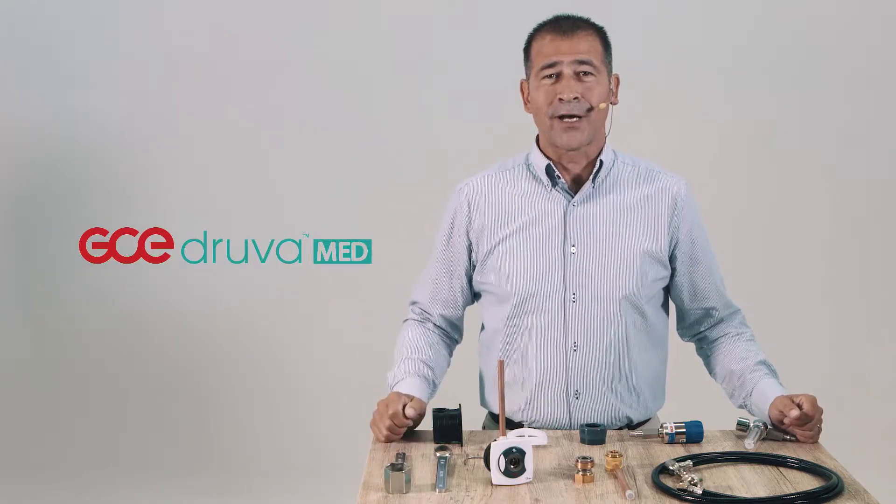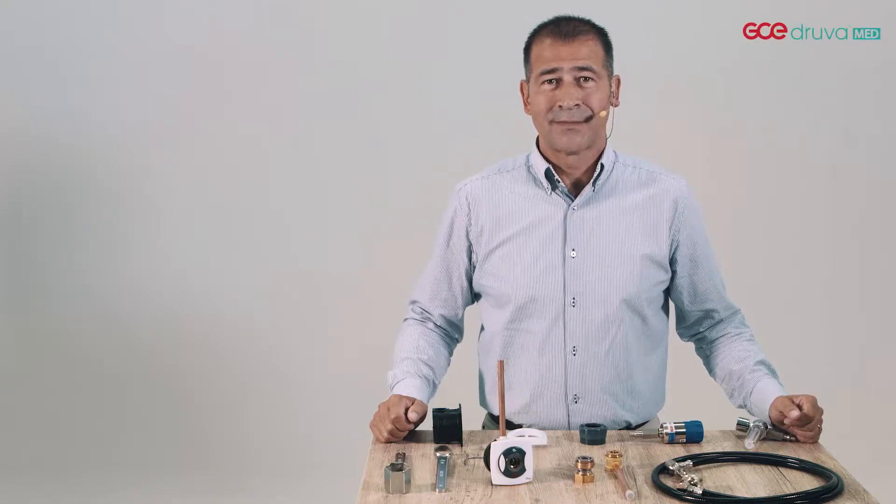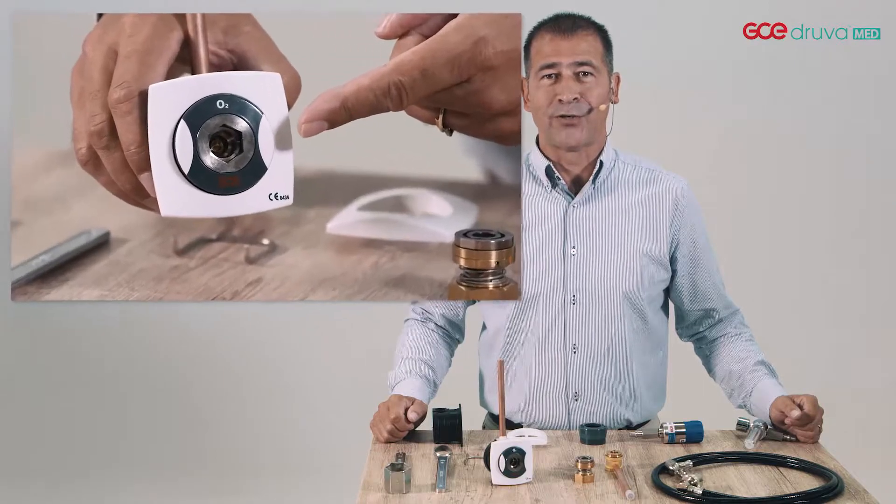Hello, I'm Mike from GCE business unit DruvaMed. I'm here today to tell you about our new medical gas outlet MediUnit.